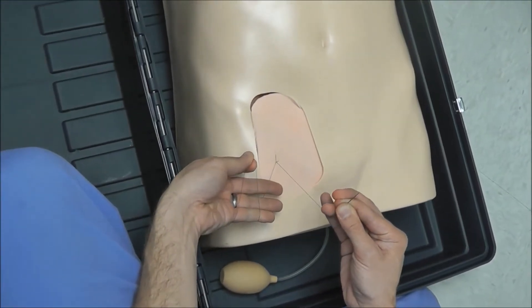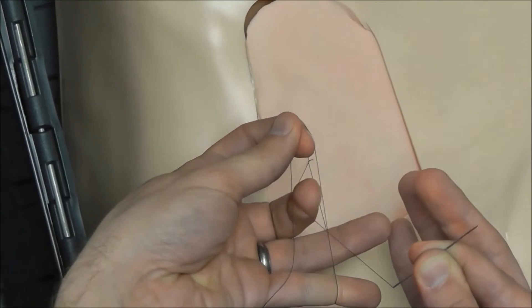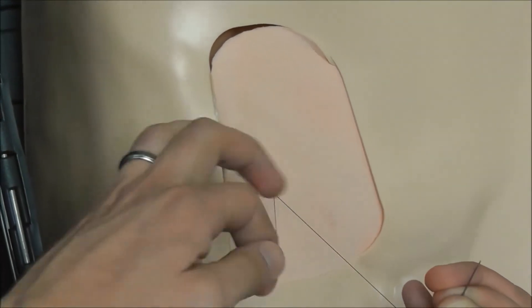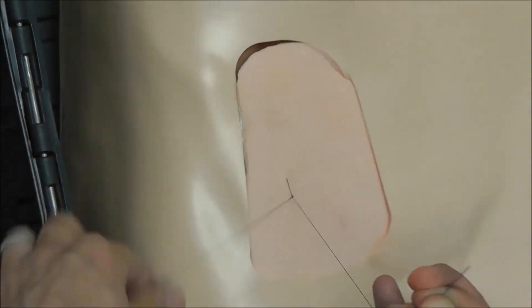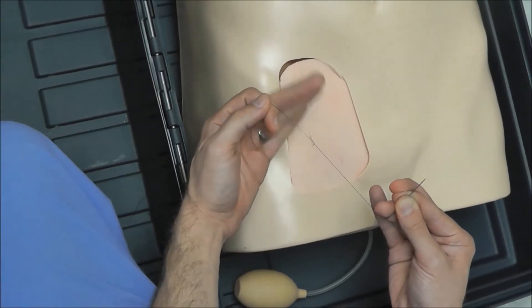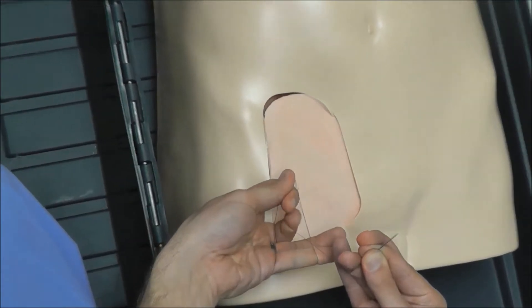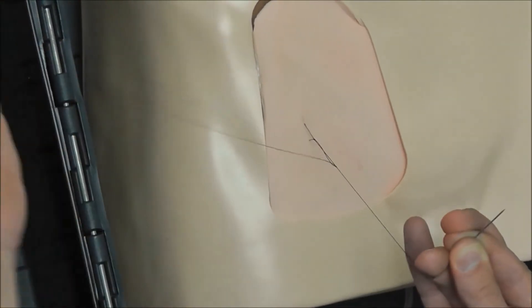So I wrap it on top of my three fingers, pull the right line under the left line, and pull the left line through. That's the type of knot that you start with. Wrap it around like that, pull the right line under the left, and then pull the left line through.